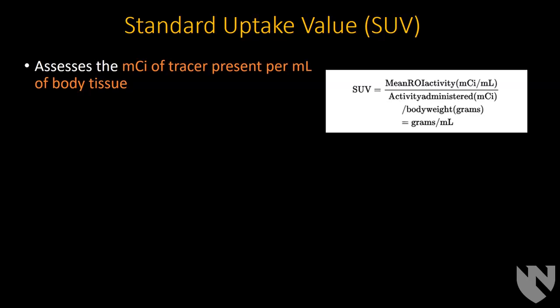anything else. So if a patient is a large size, it doesn't account for whether that's all fat or whether that's muscle. Muscle has a typical SUV of pretty close to 1, so with a really heavy but muscular patient, you wouldn't expect their SUVs would really be affected.